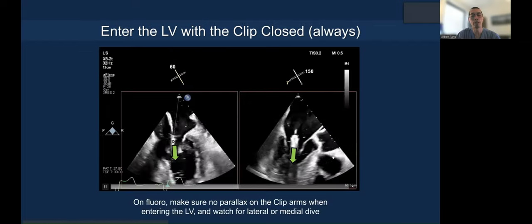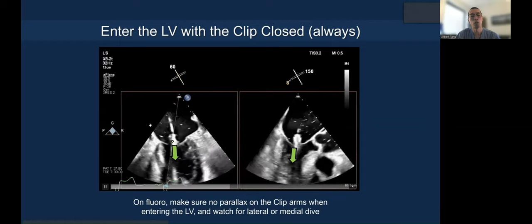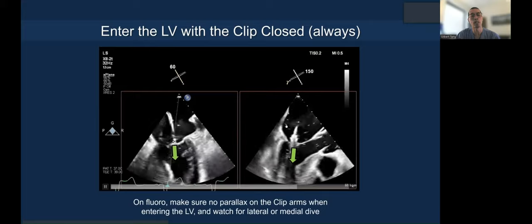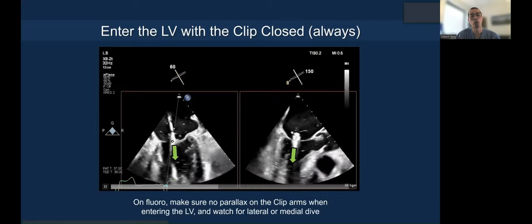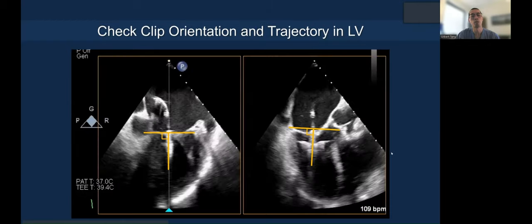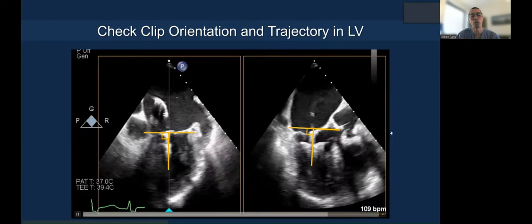Here's how you go in — nicely tangential. This is coaxial perpendicular to the annular plane, and this is coaxial and tangential in the 2D grasping view. You can watch for that and see mathematically how the relationship works.